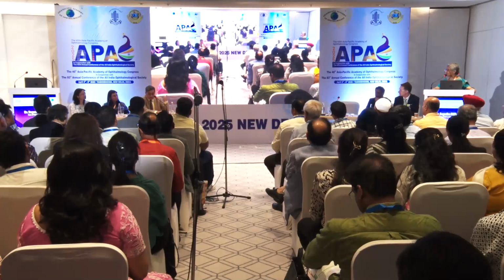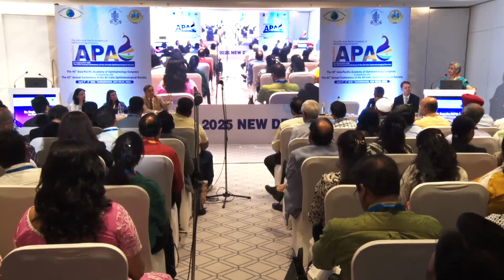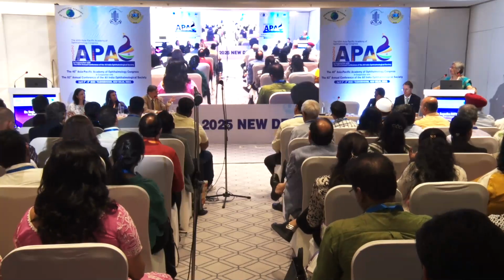I think one message was clear, that when you're evaluating the OCT, check the signal strength. If the signal strength is not good, you could get a misleading picture. That's one. The second thing is, changes in OCT can give you the basis for screening with a field, which takes much longer. And thirdly, if you have a situation where the OCT on a sequential follow-up is showing changes which are increasing, you may use it even for treatment. Absolutely, absolutely. In addition to this, if there are any other questions from the house, please go ahead.